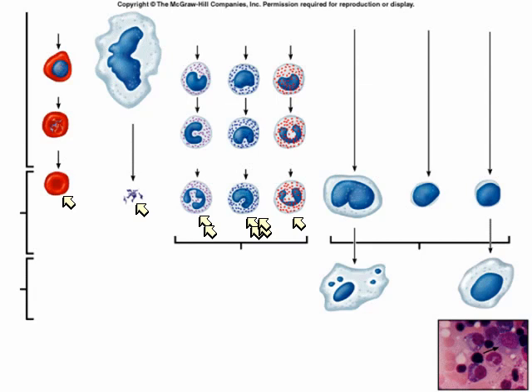So the neutrophils, basophils, and eosinophils together, all 3 of those, in your lecture you are learning that those are granulocytes because they do have distinct granules in their cytoplasm. Okay, I will erase all of these arrows. Let's move to the next white blood cell.